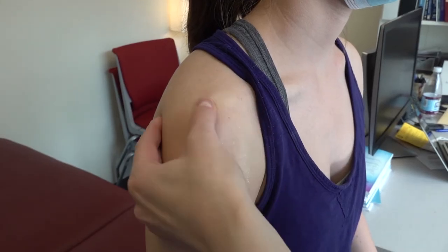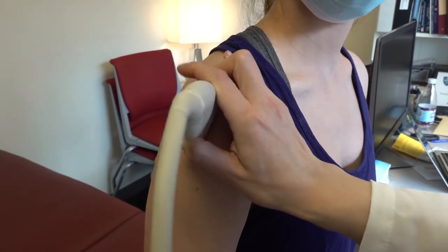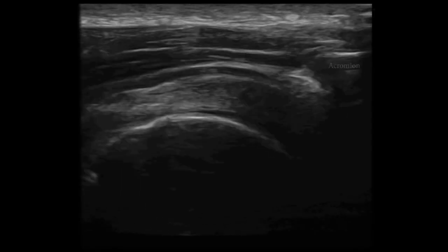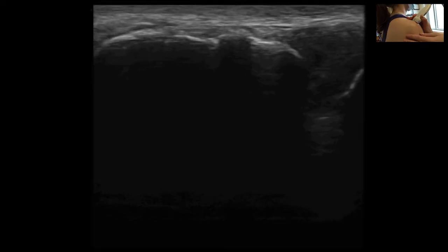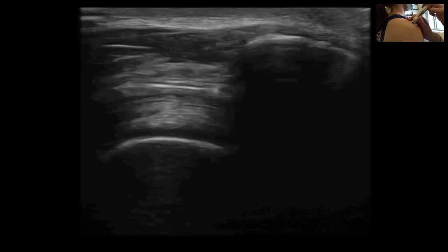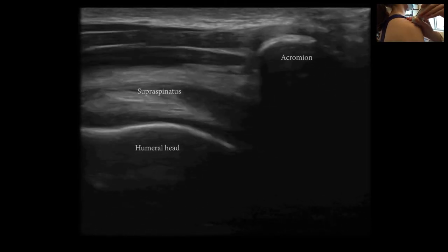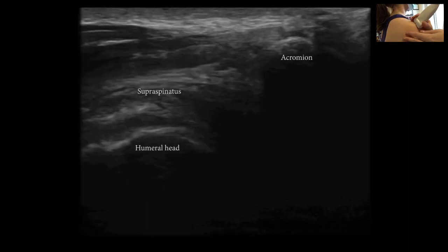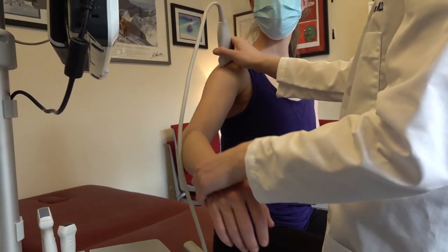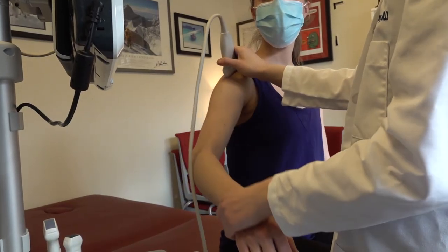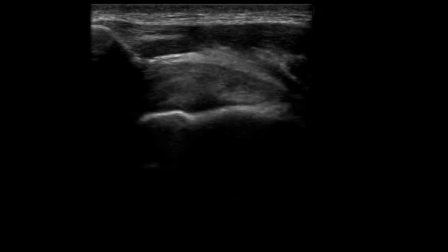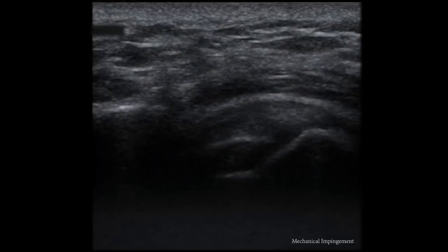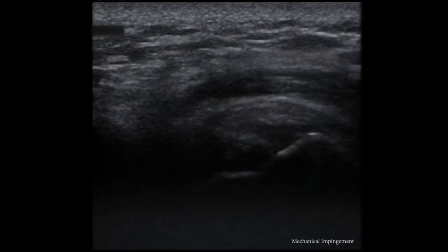Palpate for the acromion process. Place the ultrasound probe at the acromion and visualize the acromion and humeral head; the supraspinatus travels between these two structures. Alternatively, with the probe at the AC joint and the marker facing the patient's right, rotate the probe so the marker is oriented cephalad and visualize the acromion and humeral head. Use dynamic evaluation with shoulder abduction to assess for impingement. If the patient reports pain correlating with movement through this arc yet you do not visualize pathology, the patient may still have symptomatic subacromial impingement.